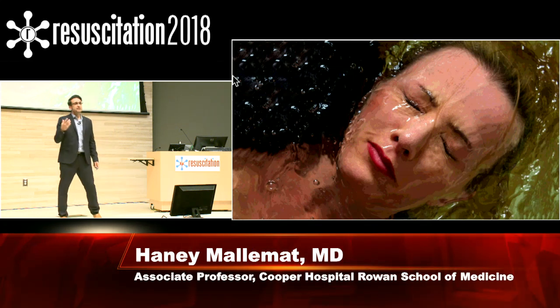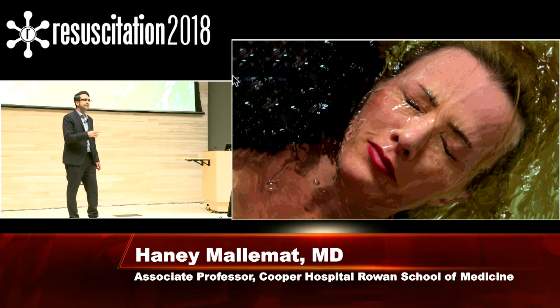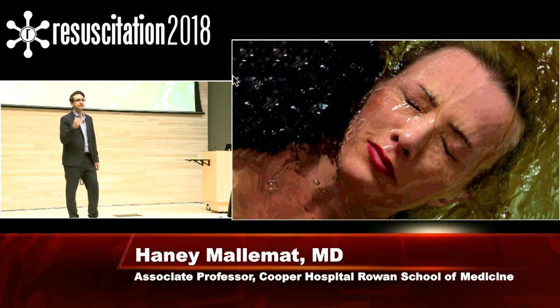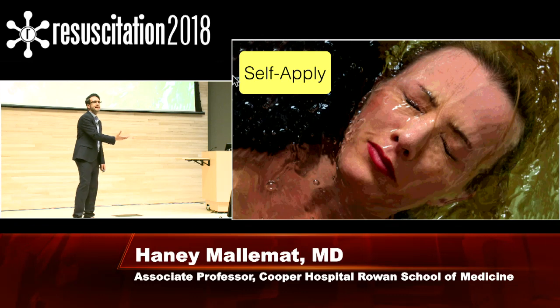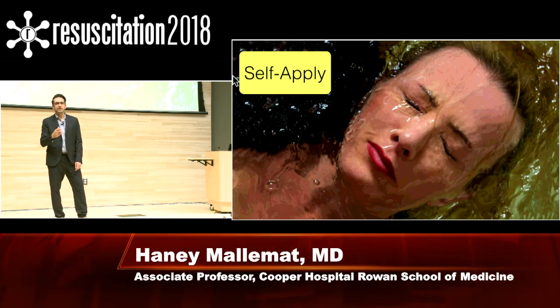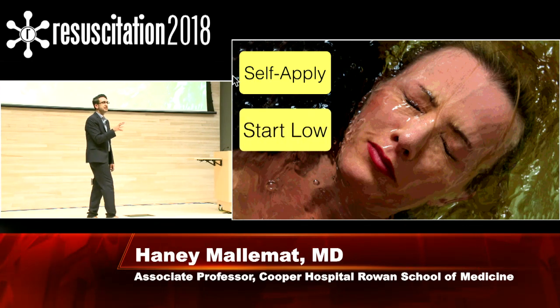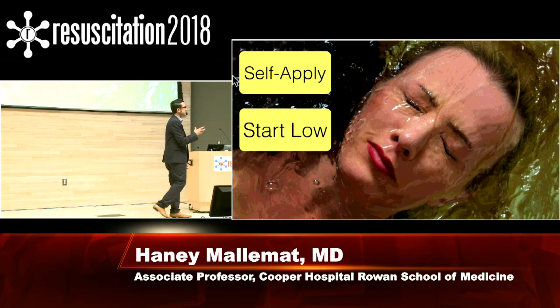It happens because patients have had bad experiences with it. So I want to give you an alternative to just shoving the mask on their face, and it's trying this method. When they come in, give the patient the mask and empower them and say, I'm going to let you apply this mask when you feel ready. So I give them the mask, and I put the settings really low. I'll put it on 3 or 4 centimeters of water. I say, when you're ready, put it on.